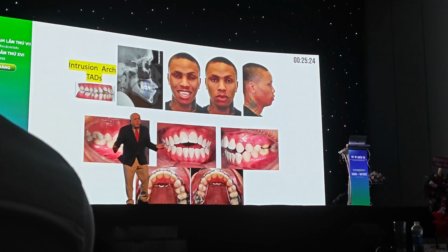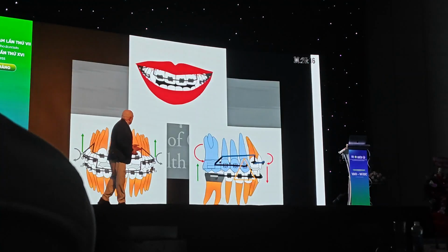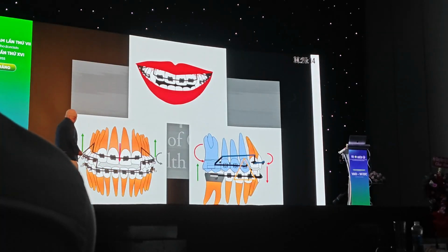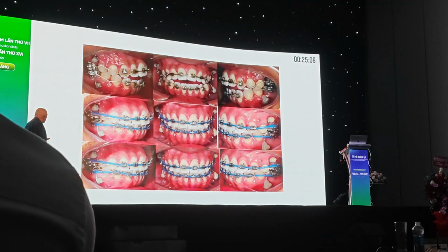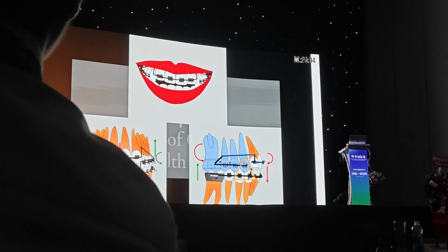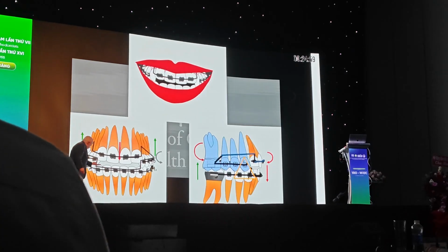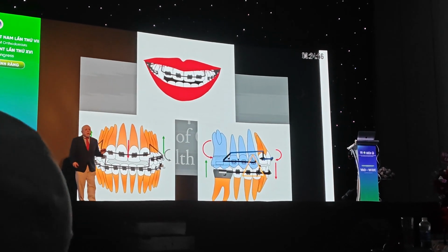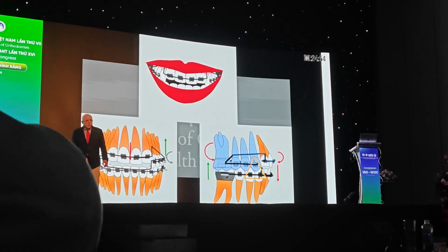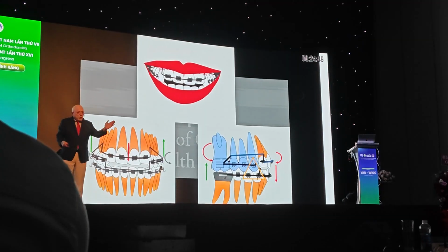But in orthodontics, we are like slaves of brackets and wires. Anytime a patient comes in, put all the brackets in the mouth. You don't need it. So take a look at it. We are going to use a force system here of an extrusion arch. Because what we want to do is put an extrusion arch to bring these teeth down, take care of the side effect in the posterior region, and move the lower teeth a little bit up. This is what I call precision orthodontics. It's not like you throw a liner in the mouth, go home, see you in 3 months.